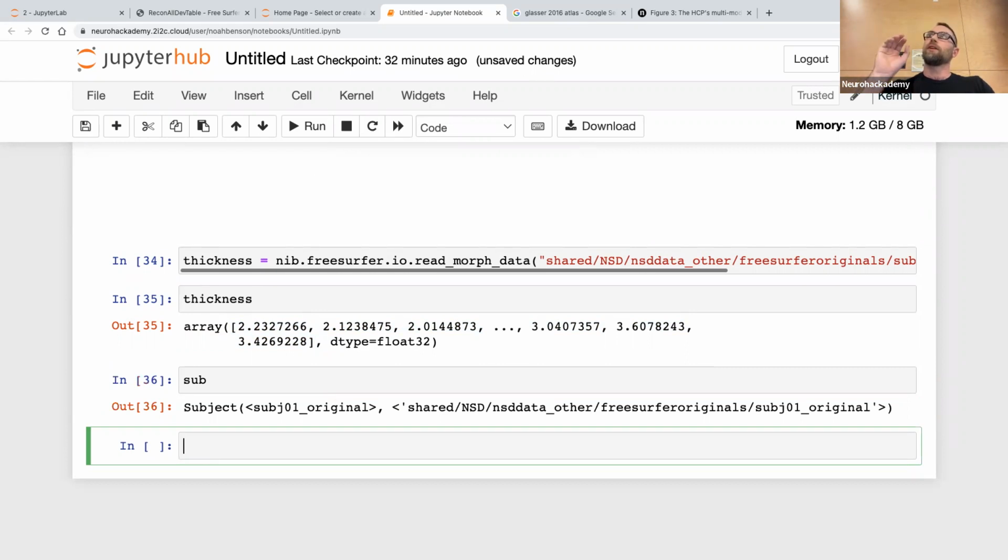Basically, especially if you're talking about a functional voxel, your functional image is going to have a different orientation than the FreeSurfer images, and it's going to have a different orientation than the FreeSurfer surfaces. FreeSurfer does a little bit of rotation to make sure that the surfaces are roughly aligned with the MNI brain. So you have to apply a transformation to the surface vertices, and once you've transformed them into the image space, you'll have some coordinate for the vertex, and you can just round that to integers, and you get the voxel it's in.